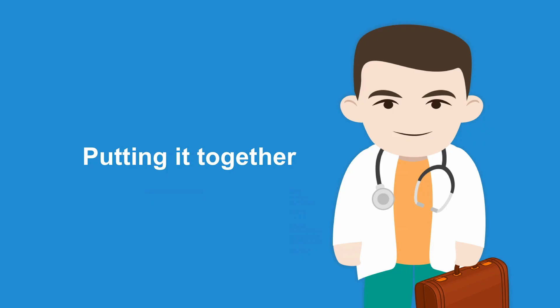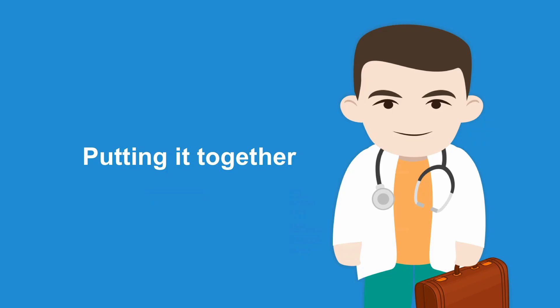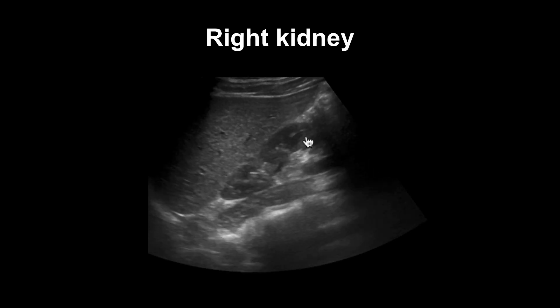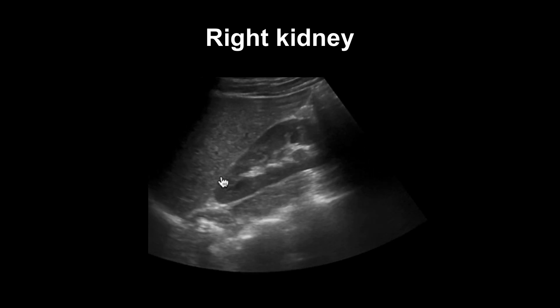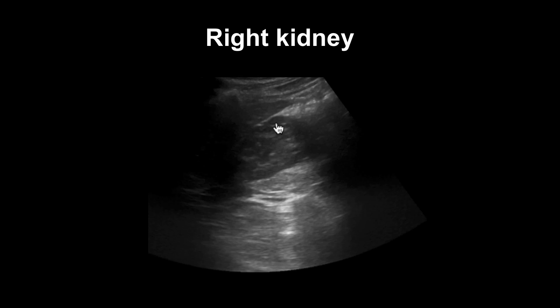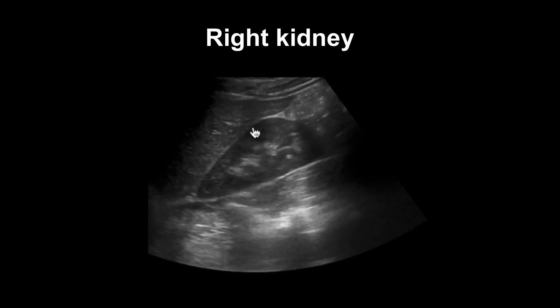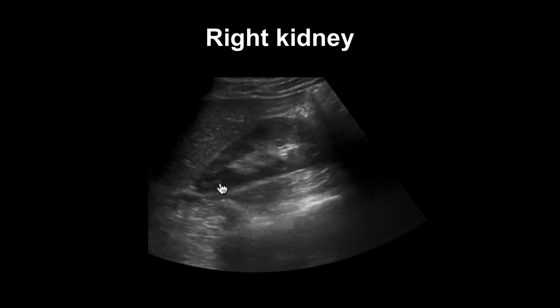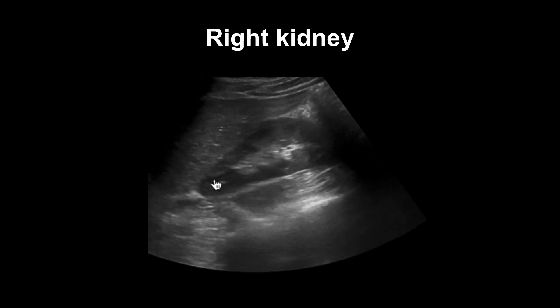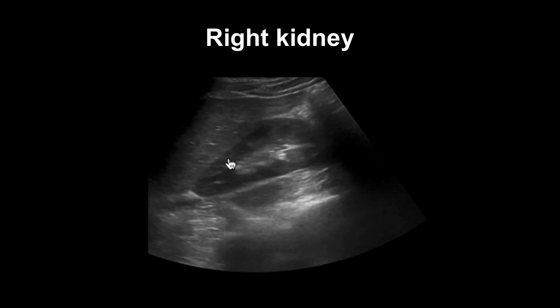Now let's see if we can find these landmarks in live ultrasound. In this video, we see the long section of the right kidney. We see the right liver lobe here. We see the Morrison pouch, this echogenic line right here. We see the renal medulla as a hypoechoic region. We see the renal cortex.